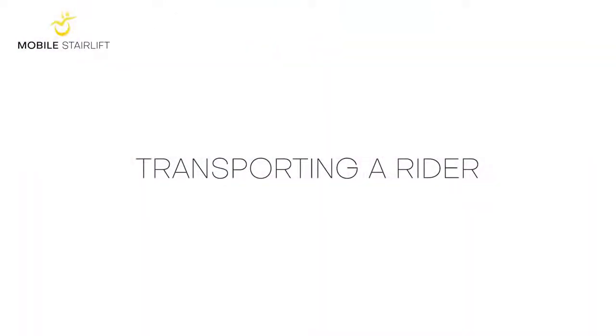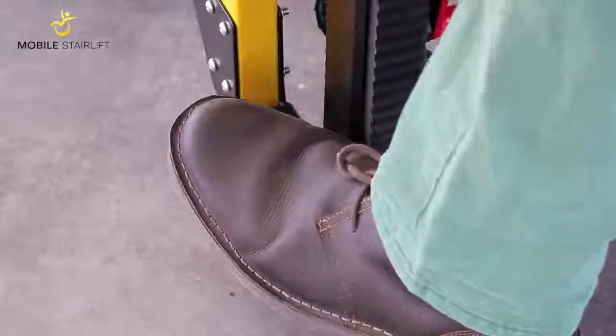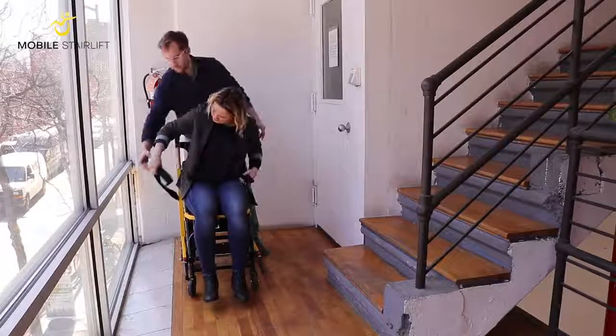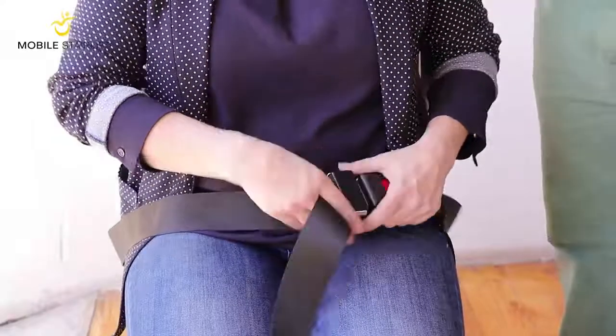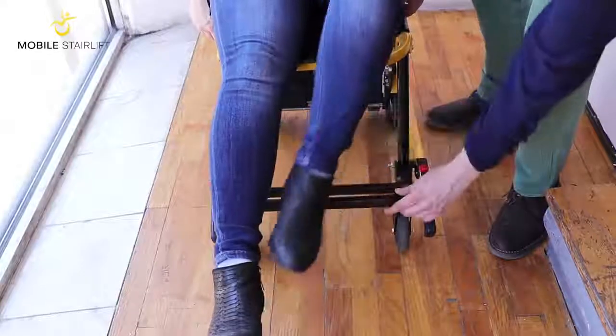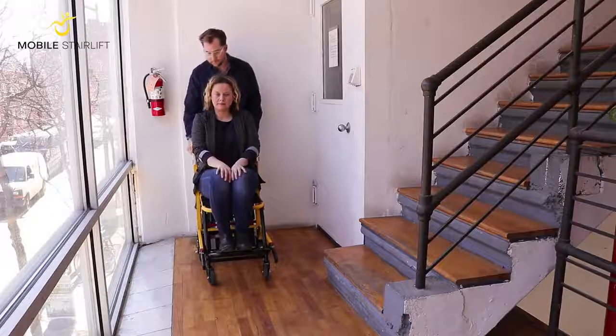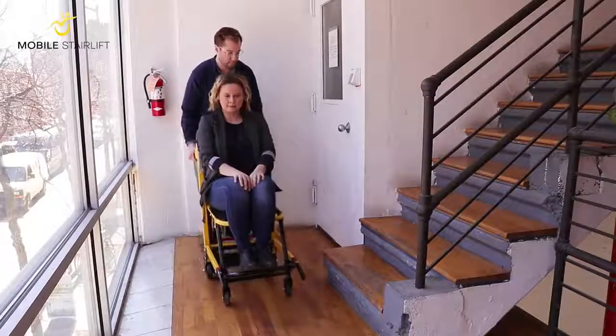Before the rider sits down in the seat, make sure that the stair lift is completely unfolded and that the rear wheels are locked. Once the rider is seated and before unlocking the wheels, make sure that they are strapped in with the safety belt and that their feet are resting on the footrest. The rider must always be secured by the safety belt when the chair is in motion.